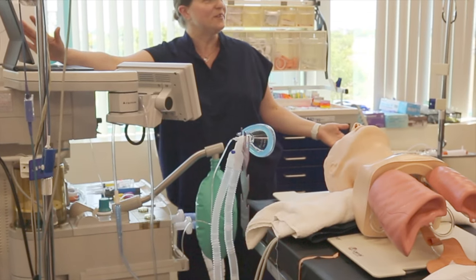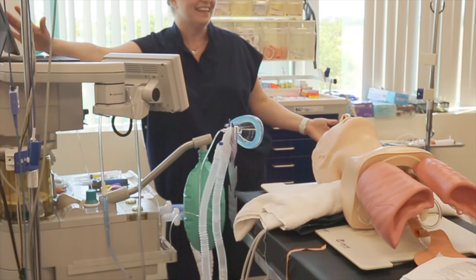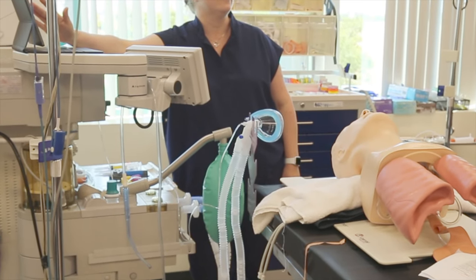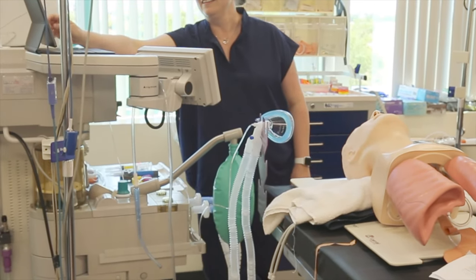What's a good SpO2 alarm? 94. Well, you don't want it to alarm if you're going to... 92, 94. Yeah. Okay.